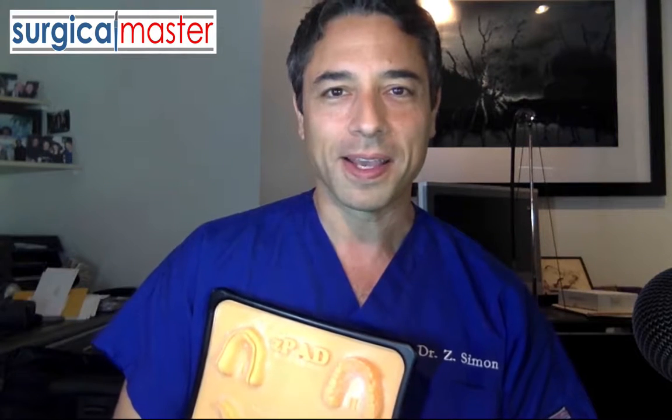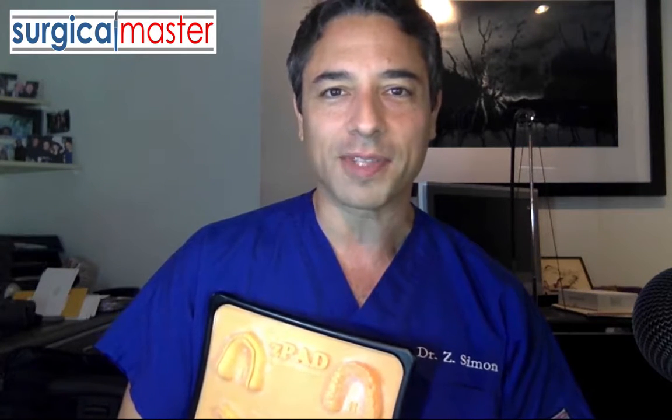Hi everybody, it's Yves Simon here of the Creative Surgical Master. Thank you so much for your interest in the Z-Pad Suturing System. This is a system I developed for dentists that were struggling and having all sorts of issues with dental suturing.